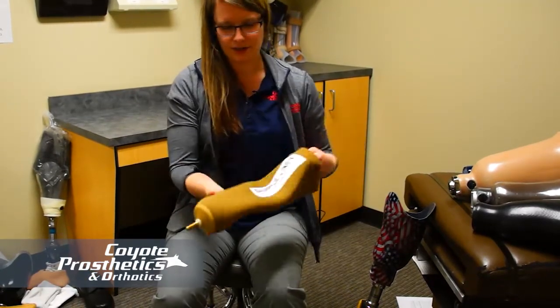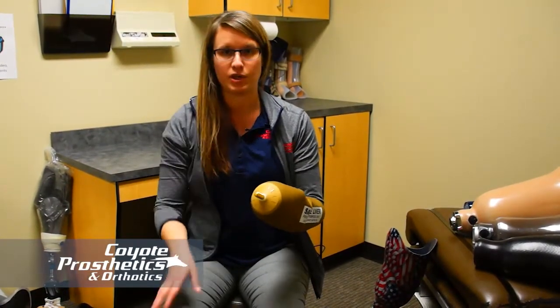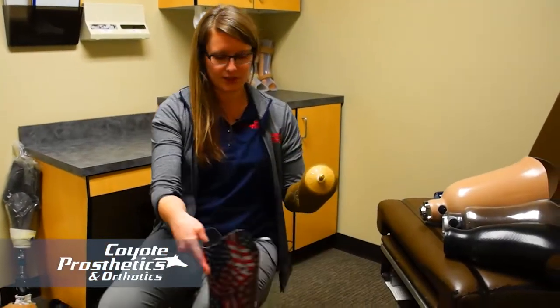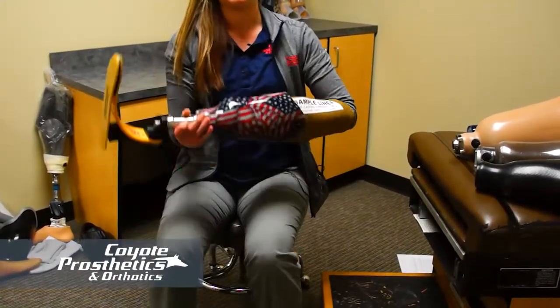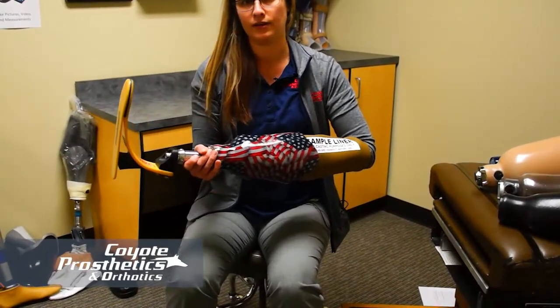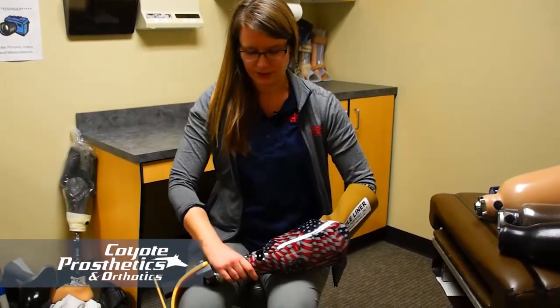Once you have your liner on, and this one has the pin already attached to the liner, this is how your prosthetic is going to stay on. You want to take your leg and just push it down into the pin lock. If you listen really close, you can hear the pin clicking in. So that's what that sounds like. And then to release it, we'll do that.